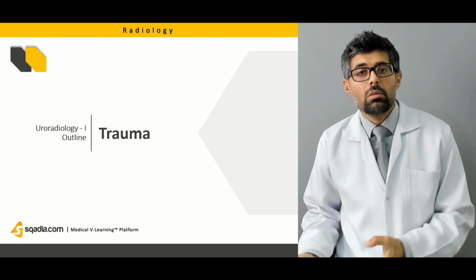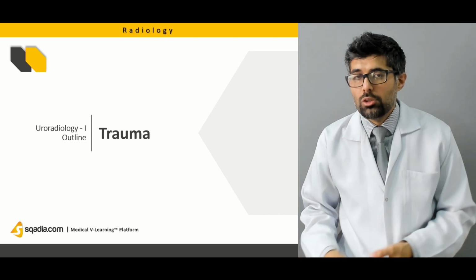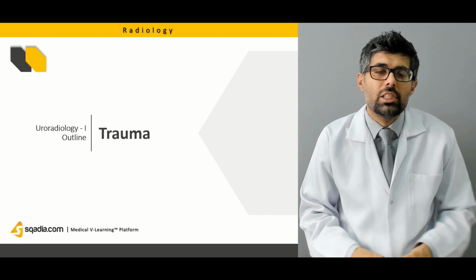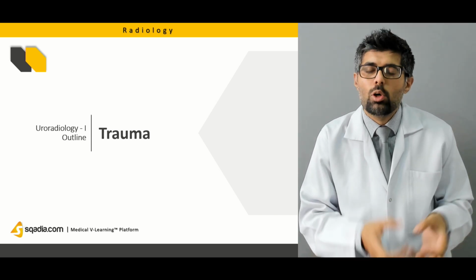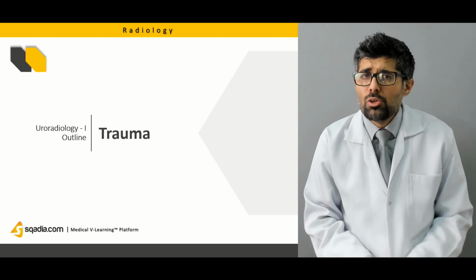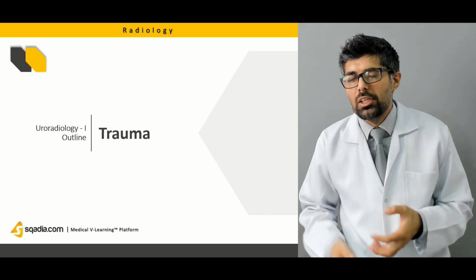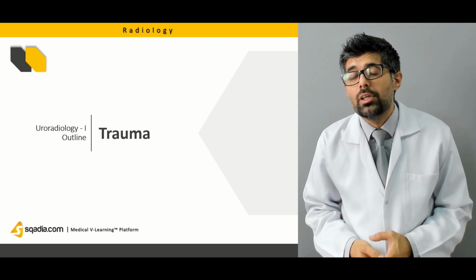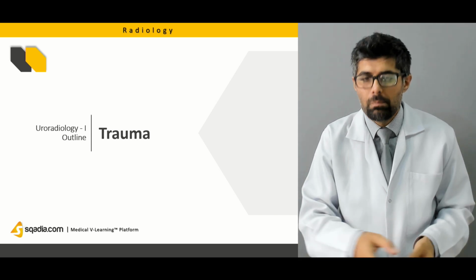Now, which trauma leads to no imaging, which trauma leads to the selection of a radiograph, what kind of trauma leads to the selection of a contrast enhanced CT scan, and which kind of trauma leads to the selection of a FAST exam or a cystograph or a urethrograph. So we will be studying about all of these modalities, their selection, their choice, and in which scenario which one is preferred, and what advantages which modality has over the other one.